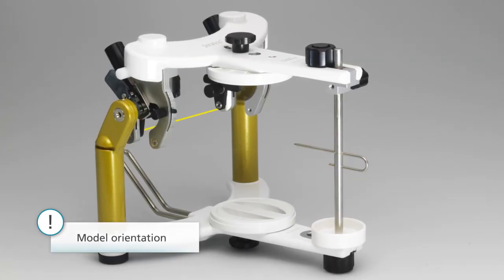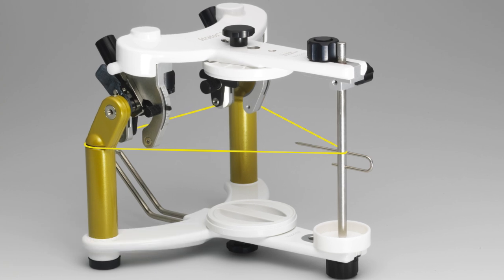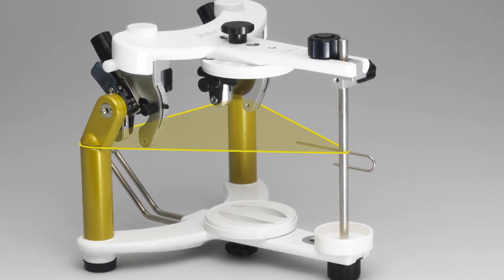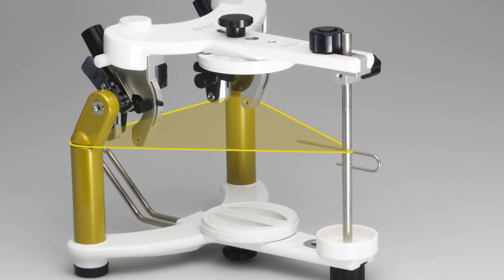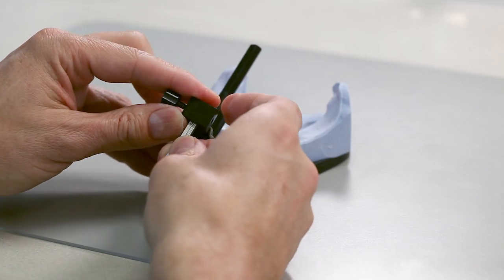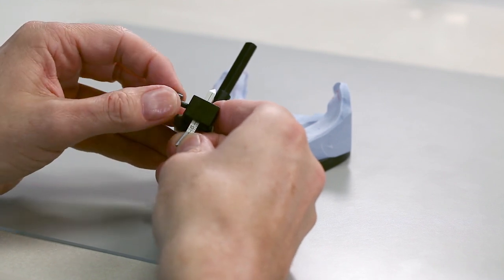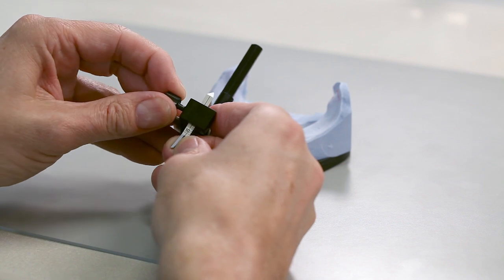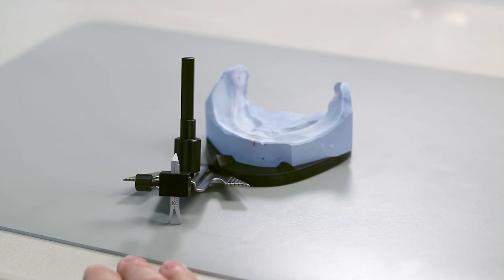With the help of the horizontal guide, align the mandibular model in the articulator according to average values. This ensures that the models are positioned within the Bonneville triangle according to average values. Before mounting, set the symphysis fork of the horizontal guide to half the intervestibular distance. This means half the distance between the mucolabial folds of the mandible and the maxilla.